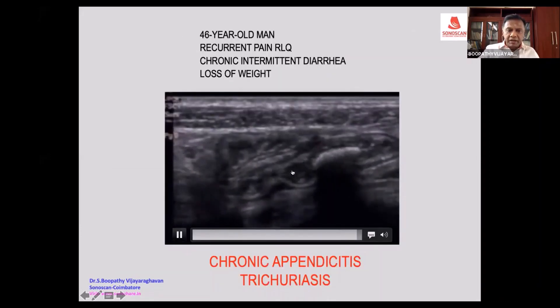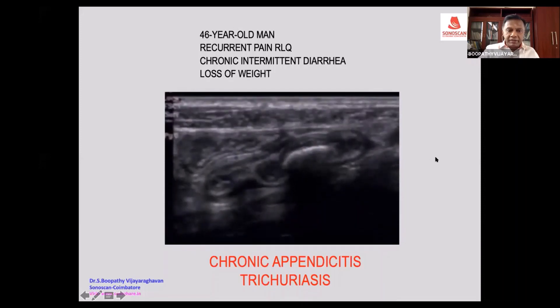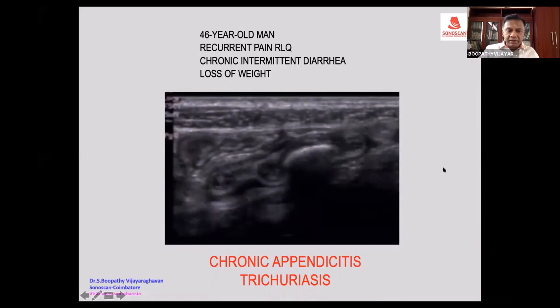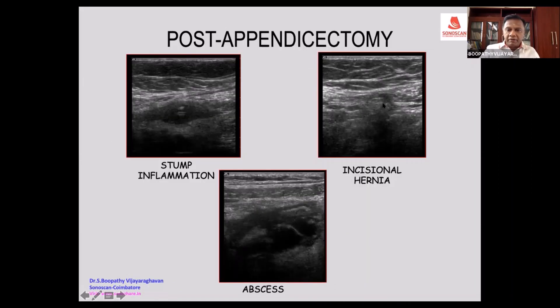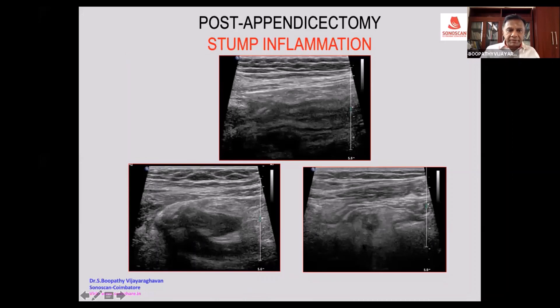You see movement in the lumen — this is due to worm movement. There is a slightly thick-walled cecum but a markedly thickened appendix that is retrocecal. On cough, there will be a bulge. There may also be an abscess in the right iliac fossa following appendicectomy.